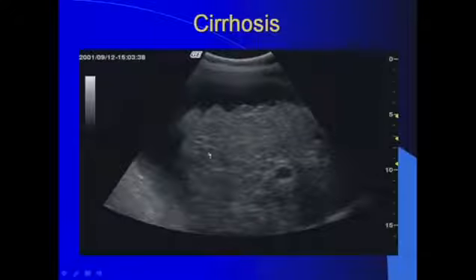Now, one important thing is whenever you look at the liver surface and you start to see some bumpy, lumpy nodularity on the surface with some mimics of masses, like in this instance, which is bigger than 1.5 centimeters, you should include in your report that you are suspicious that this could be a dysplastic nodule, and further imaging with MR or multi-phase CT scan should be performed to exclude the possibility of HCC.